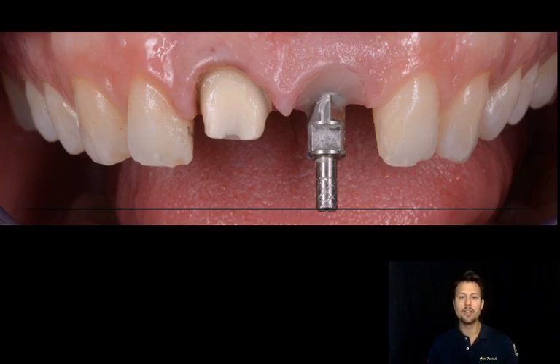And this transfer, as you see, is very long. If you see, the black line is much longer than the tooth. Why? Because the tray is open, has a hole in itself, and we should be able to unscrew the transfer inside the impression material. So this transfer is usually very, very long.